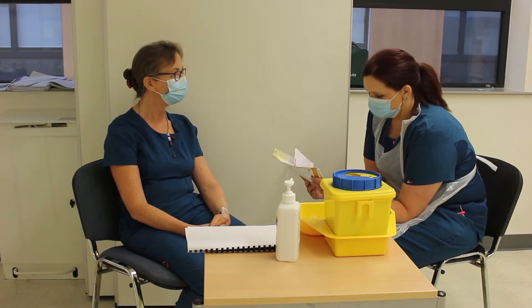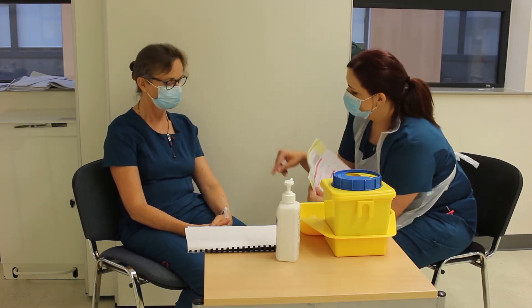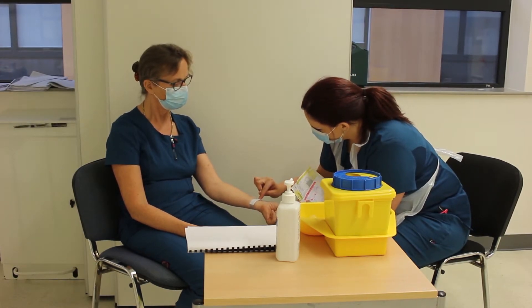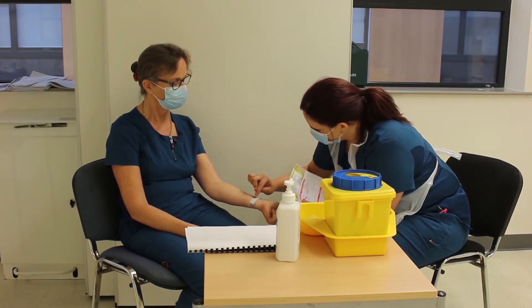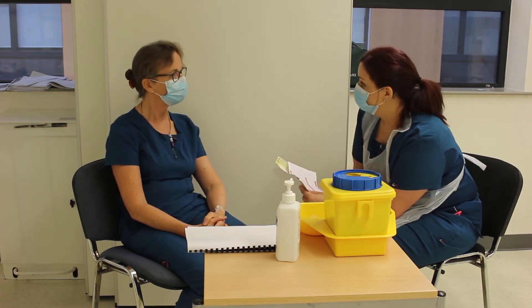My name is Judy Brown. Judy Brown, great. And what's your date of birth? The first of the first, 1991. First of January 1991 — that's perfect. Can I check your wristband? Judy Brown, first of the first 1991, and your hospital number is 123456. Perfect.